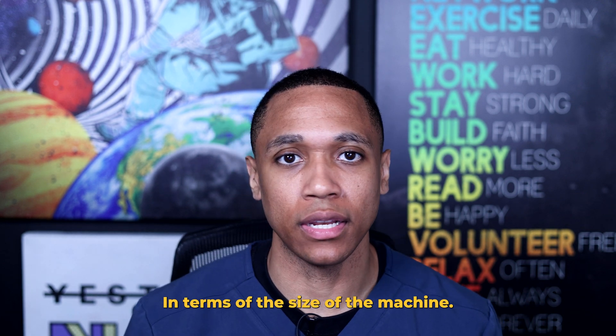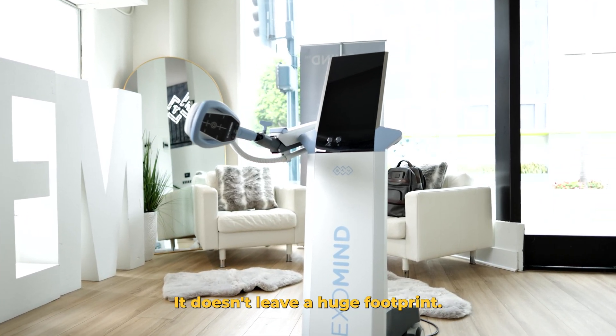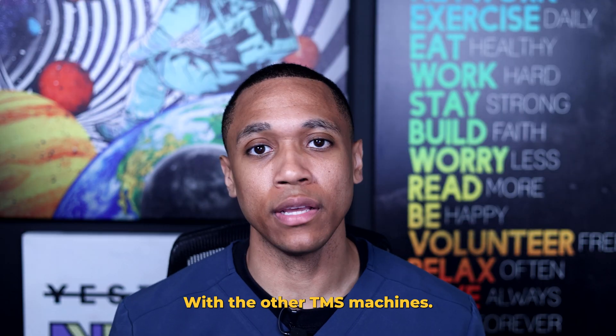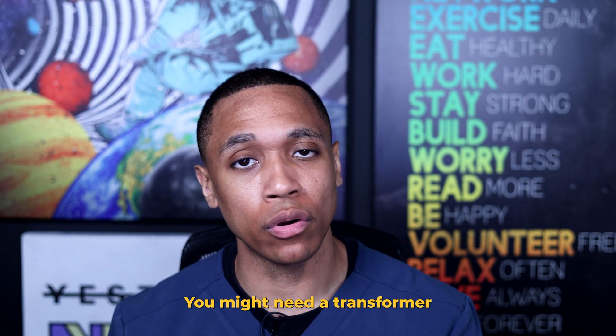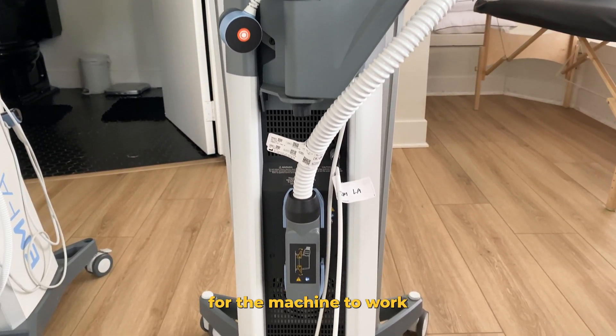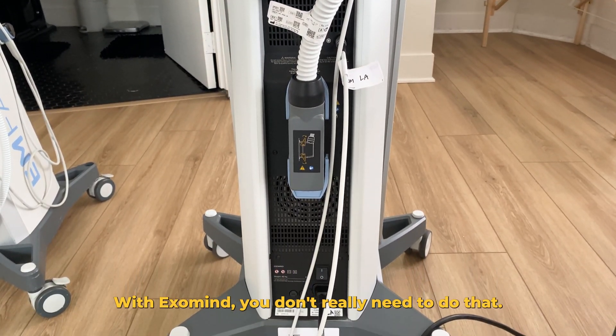In terms of the size of the machine, it is not that big. It doesn't leave a huge footprint, and you can also plug it into a regular wall socket. With other TMS machines, you might need a transformer or some other moderately expensive adjustment to the electrical system in your office for the machine to work. With ExoMind, you don't really need to do that.